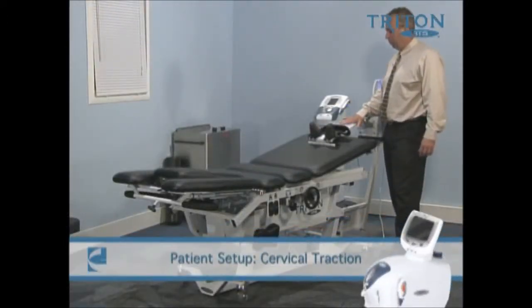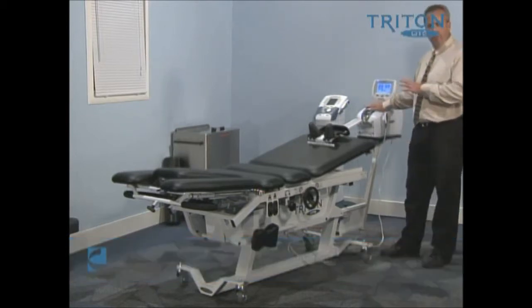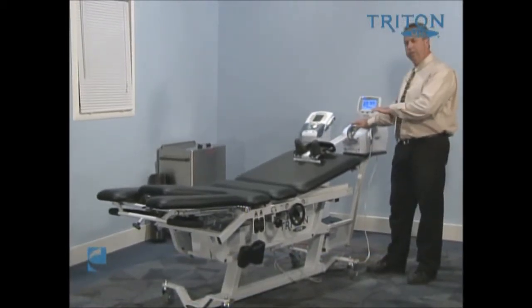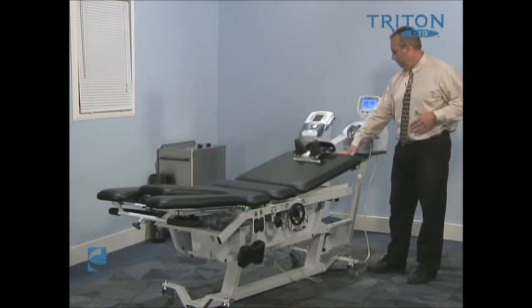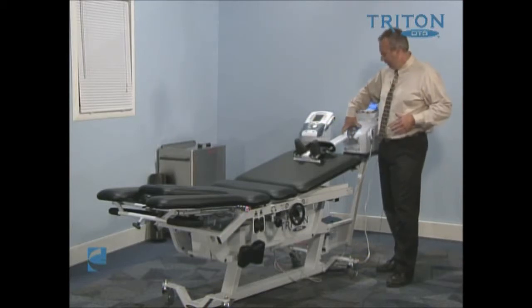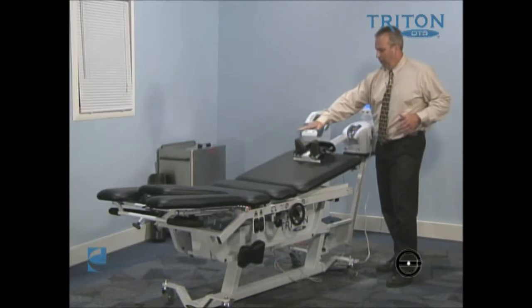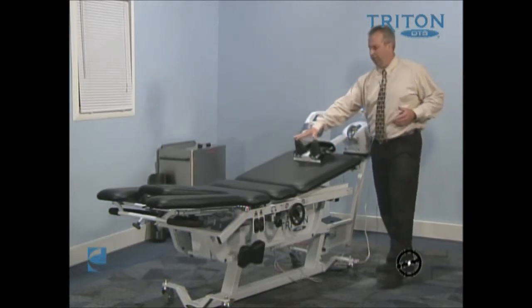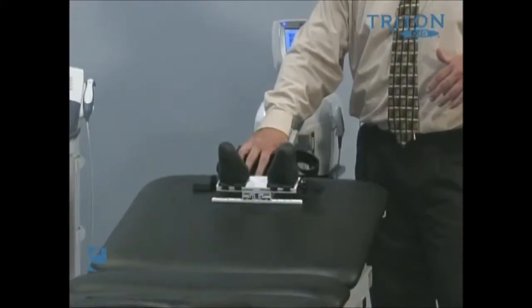Now we're going to look at setting up for cervical traction. Because the traction device doesn't move, we're actually going to change the patient position — the patient's head will go up closer to the traction device. This is a unit that connects and anchors directly to the DTS head itself, so this device does not move. We're going to attach the patient's head to the slider and pull on the slider.